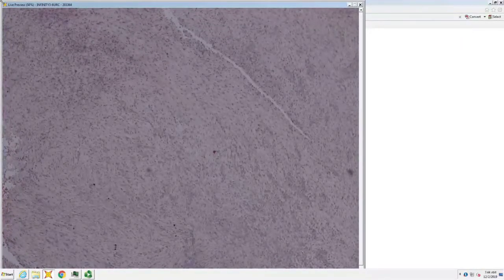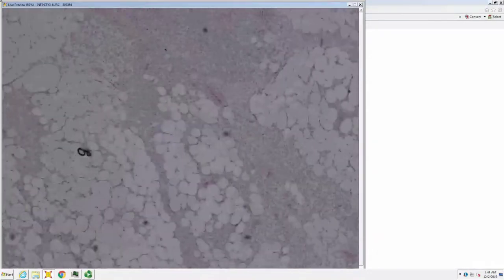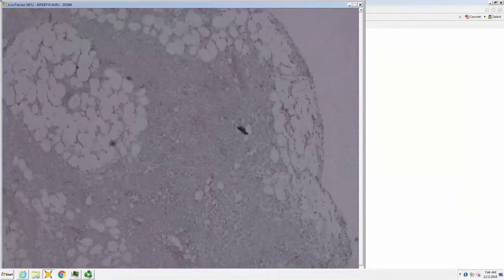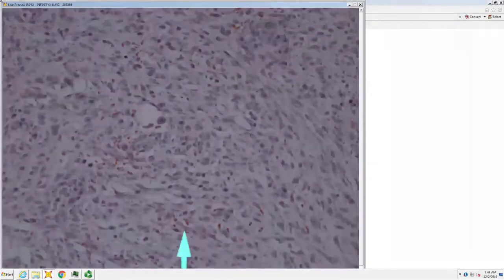So this one, again, is pretty big. And you see no epidermis, probably because we're going into the deep fat. It's going into the fat and splitting it, so it could be another DFSP. Is it storiform?